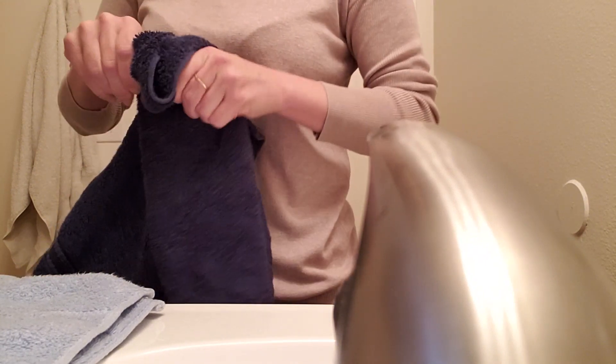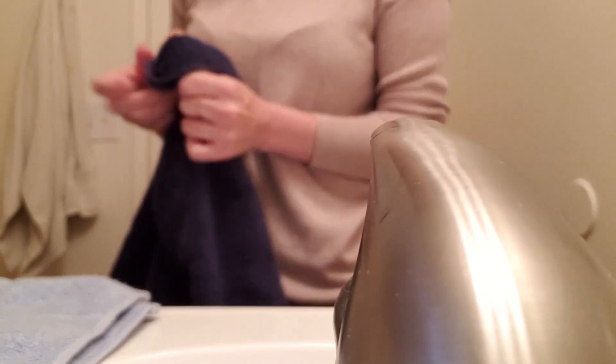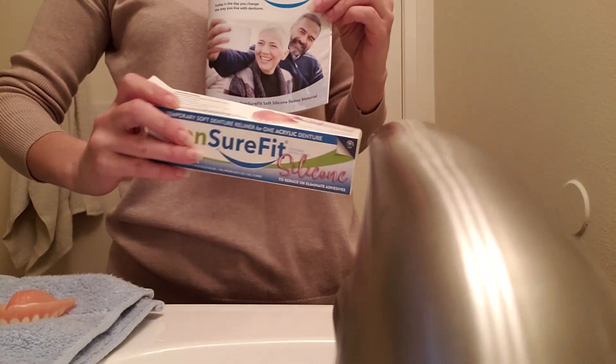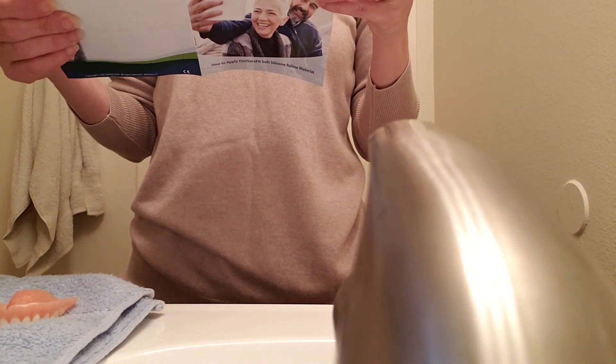I'm following this little instructional book. I watched the instructional video this morning. My life is so chaotic — I'm just thankful I'm having this moment. So this is the box it came in. It says: clean, rinse, dry your denture. For best results, wash your denture with dishwashing soap — check. Dry it with a clean towel — check. Allow it to air dry thoroughly. I'm going to let it air dry for a little bit.